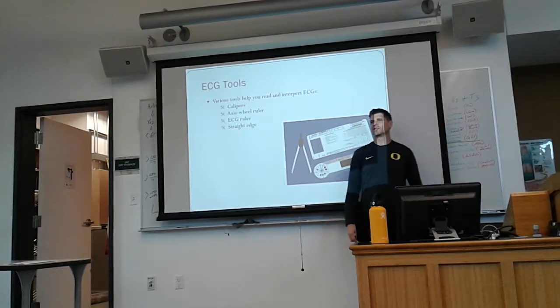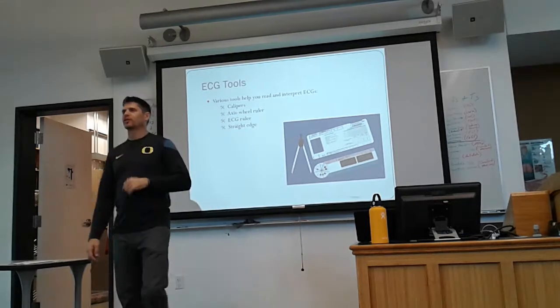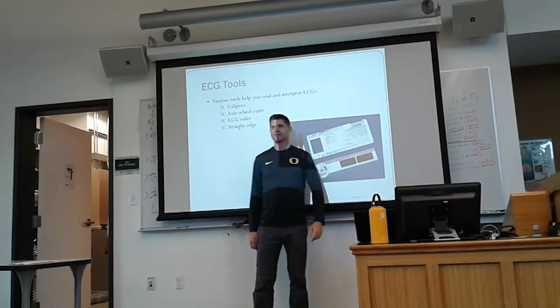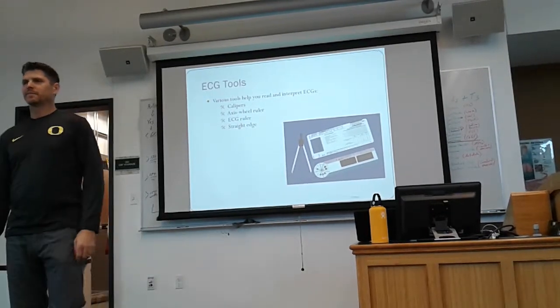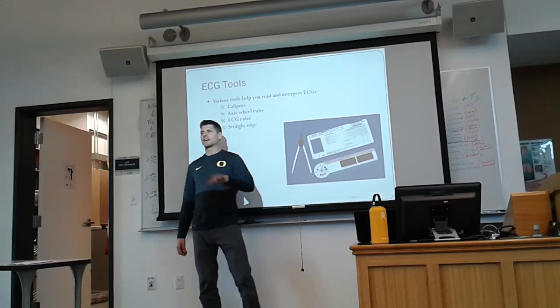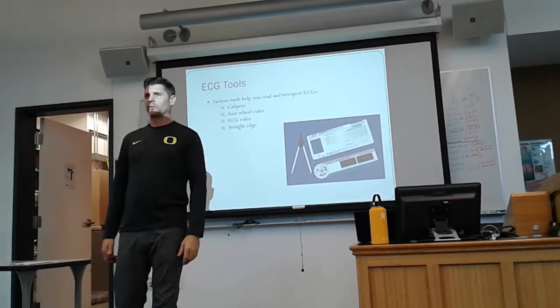What you won't be able to use will be any of the rulers that give you added information. I'm not going to let you use an axis wheel, because you're going to learn how to measure and identify the axis without the wheel. And I don't want you to use rate calculators or anything to that effect, because I want you to learn how to do that and then just do it. Good? You won't be able to use any of those tools as you move on either. You're welcome to use them on scenes as you move into the market, but you have to be able to know how to do it first. So we learn how to do it first, and then go.